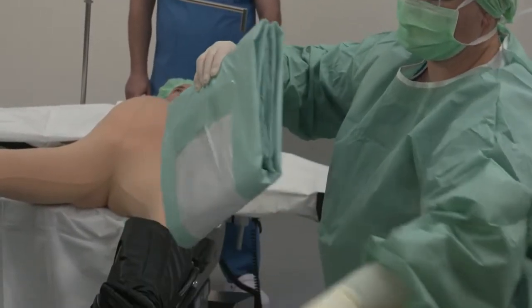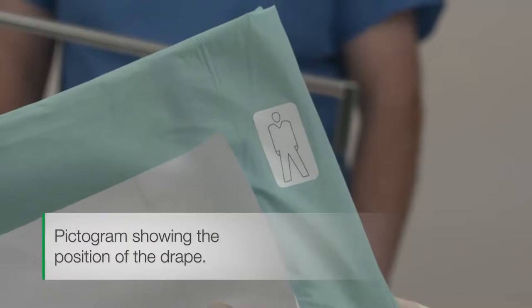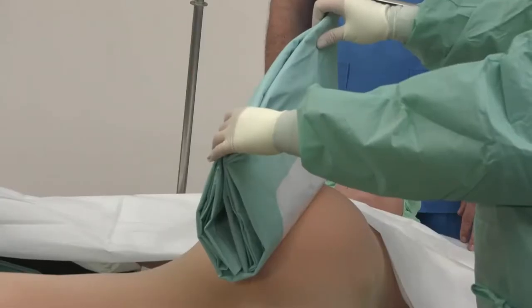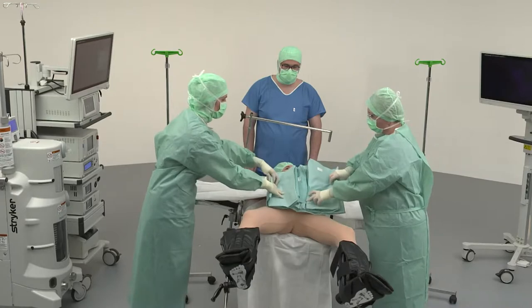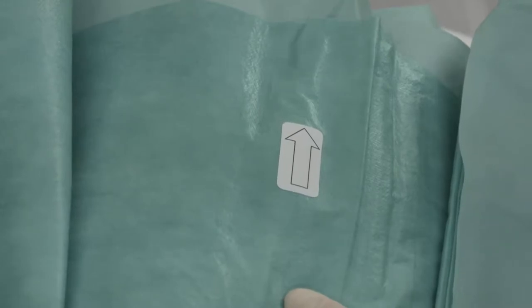The pictogram shows the correct position of the drape towards the head and feet. Now, as shown in the pictogram, position the drape like a closed book centrally over the patient's abdomen. Apply and then fix in position. Then the drape is unfolded on both sides in the direction of the arrows.